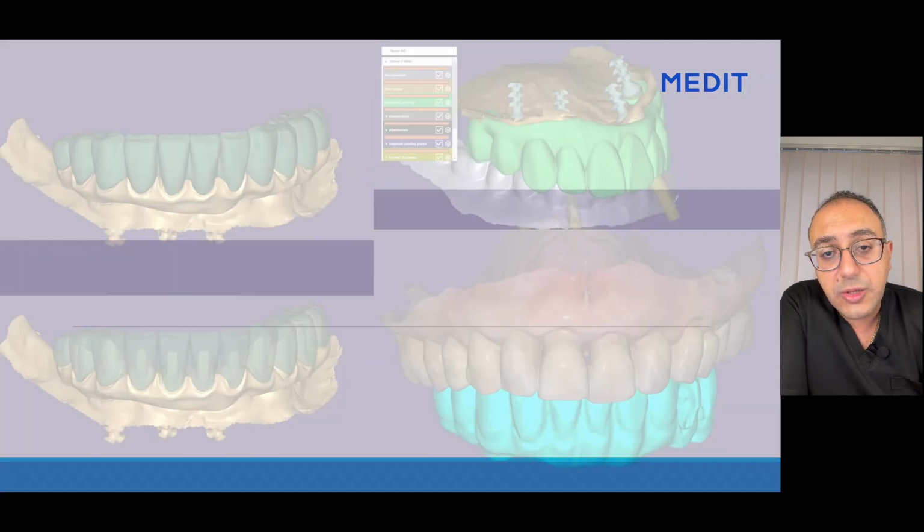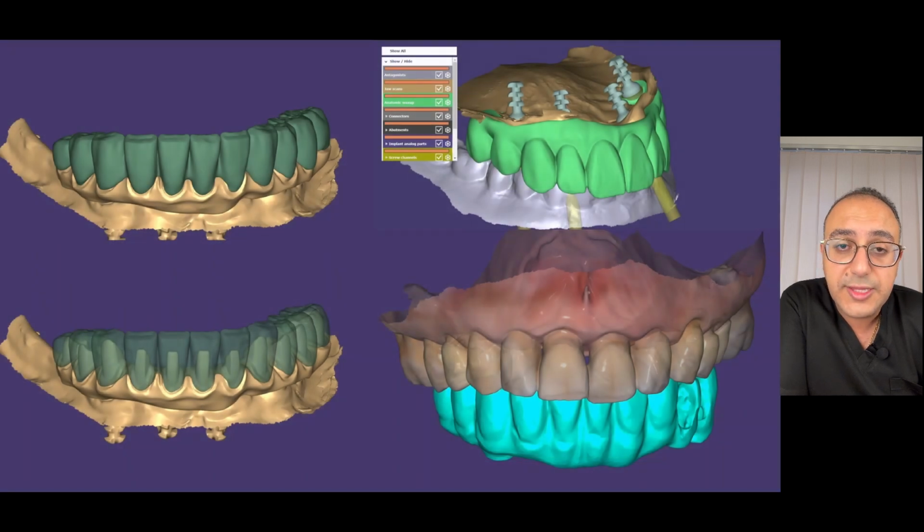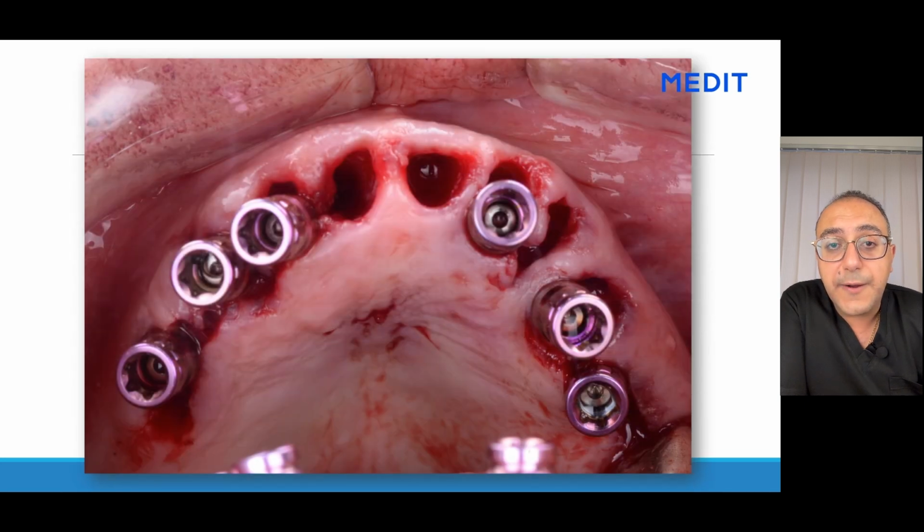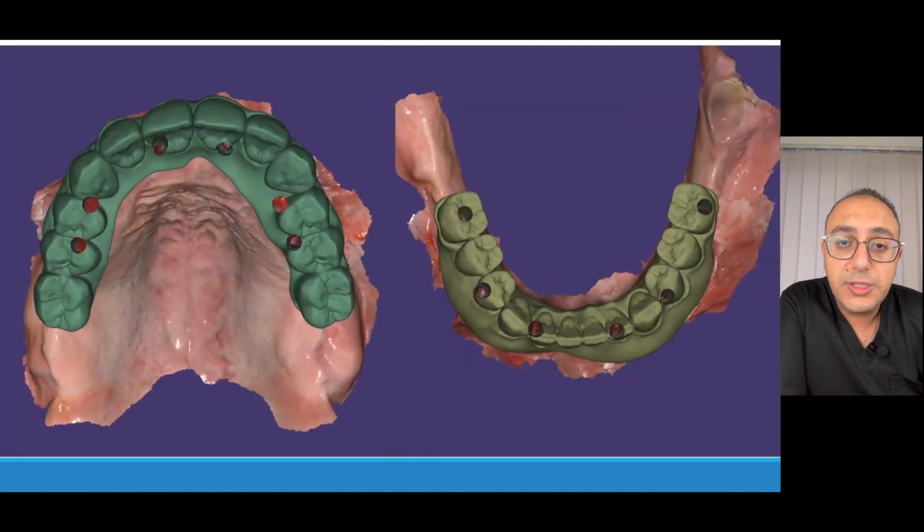And you also have to plan the prosthesis, because as we are talking, we are planning a third dentition, not only implants. So it is of crucial importance to plan the future teeth before starting, because it will help you a lot in choosing the best suitable places for putting your implants in the jaw bones. Why? Because we want the screw channels coming out of the restoration to be in a favorable place.